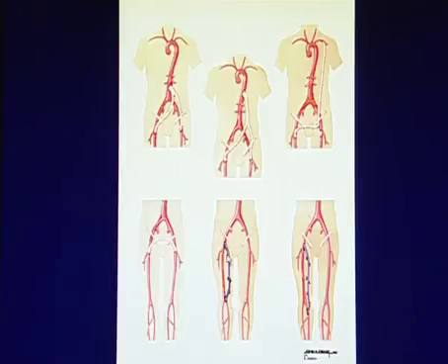Here we see a vein bypass graft that's connected to the common femoral artery up here and the popliteal artery down here. Over here, it's probably about the same area, maybe a little bit lower, almost kind of across the common femoral and the superficial femoral origin. And this time it's a little bit distal, maybe into the tibioperoneal trunk, as shown in the diagram. So it's important to save yourself some time and understand where the plumbing is so we can evaluate the exact levels we're supposed to.